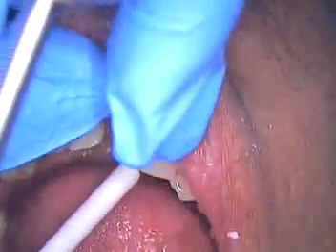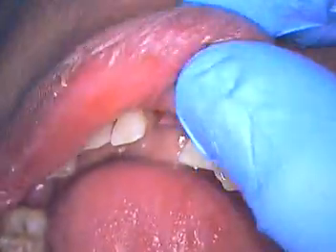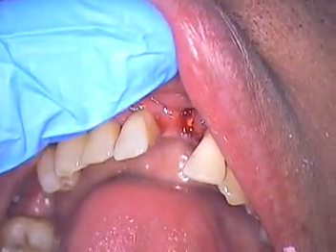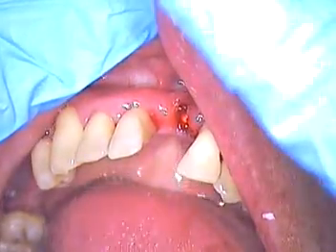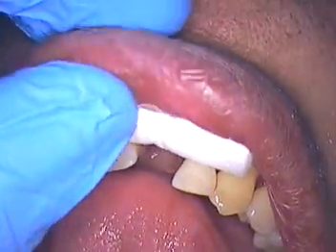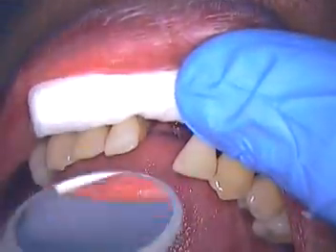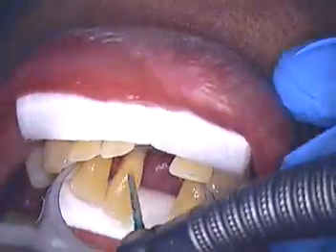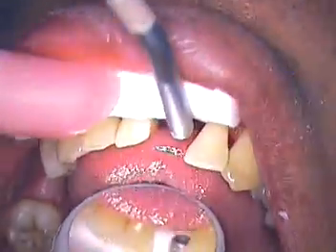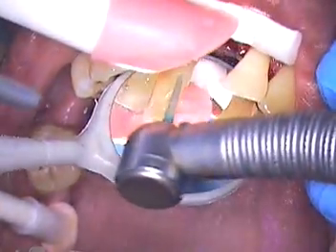I'm just going to gently continue to have a cotton roll. You okay? I'm going to clean off the back of your teeth now. I know you just had your teeth cleaned, but I'm going to make sure they're super clean. Just do that gently, air on the mirror, and relax everything.